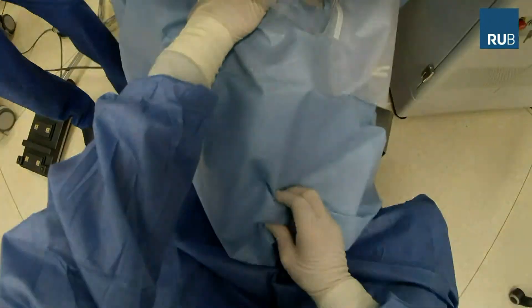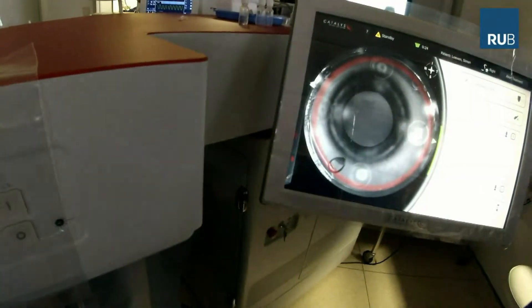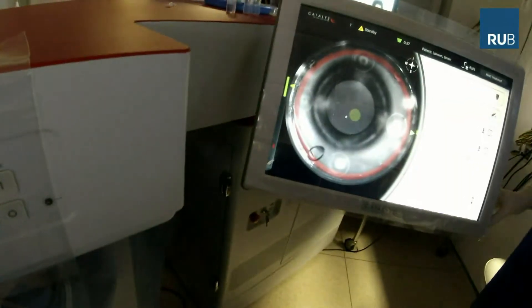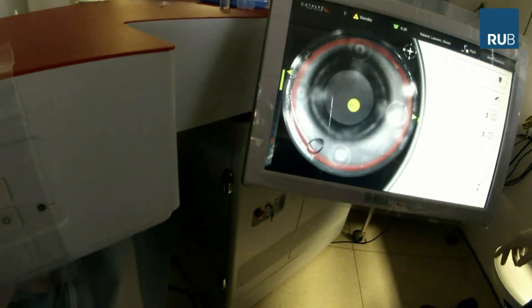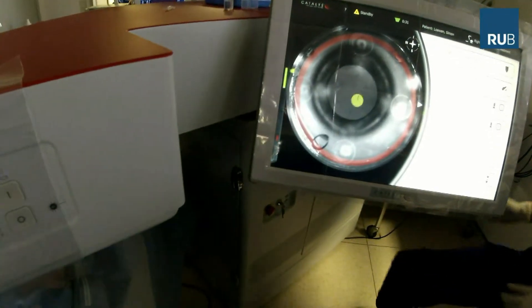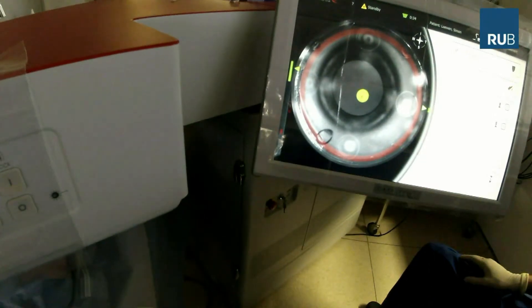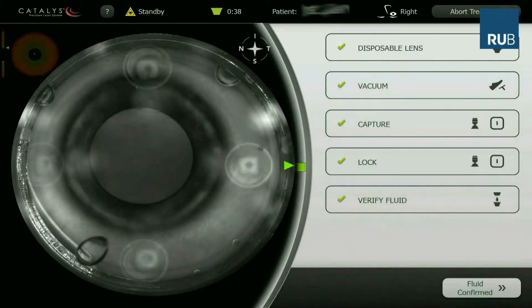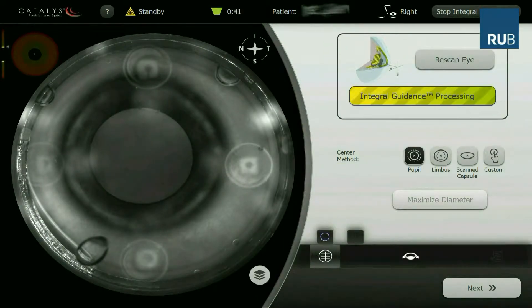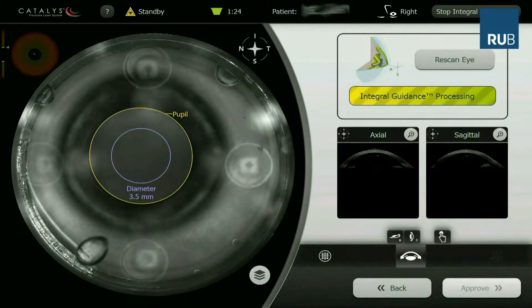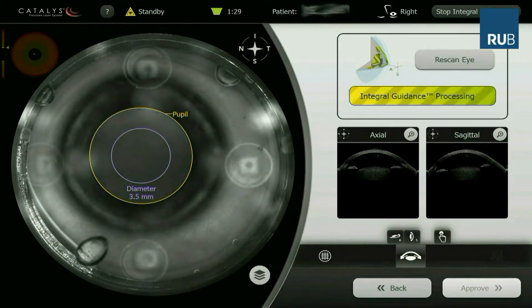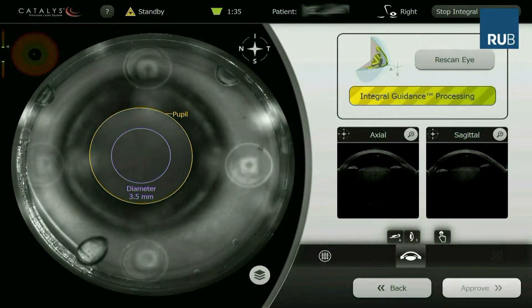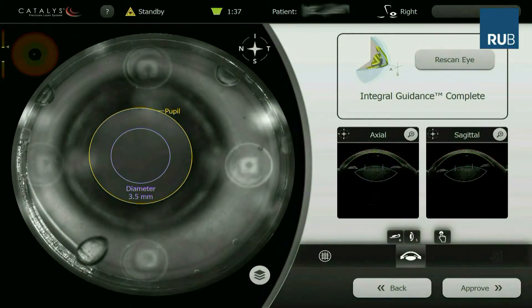Surplus BSS flows out through open channels and does not come into contact with the eye. The intraocular pressure increase is about 10 millimetres of mercury. After docking, a 3D spectral domain OCT automatically detects the ocular surfaces. The system suggests the capsulotomy which was set preoperatively at a depth of 1000 micrometres and 4 microjoules of energy with a 3.5 millimetre diameter.